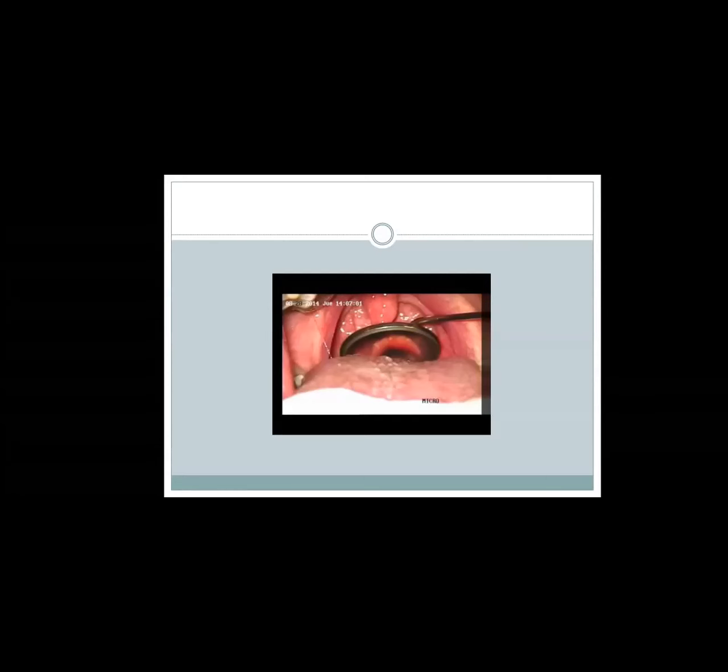In order to prevent that, you have to heat this laryngeal mirror with the help of a flame, or you can immerse it in a bowl of hot water, so that the metal and the glass become warm.